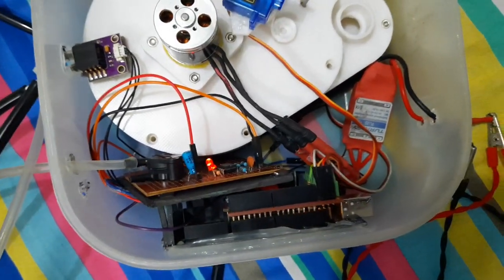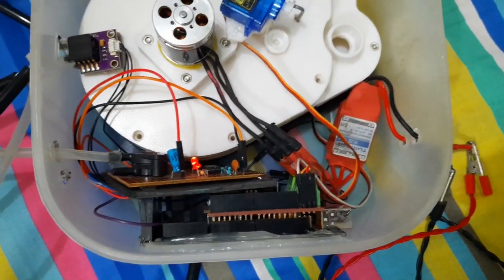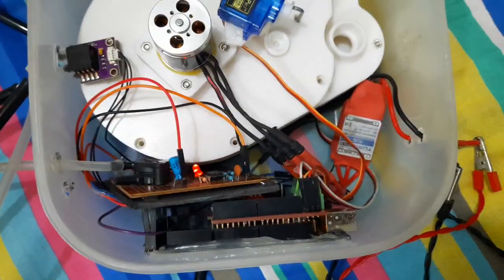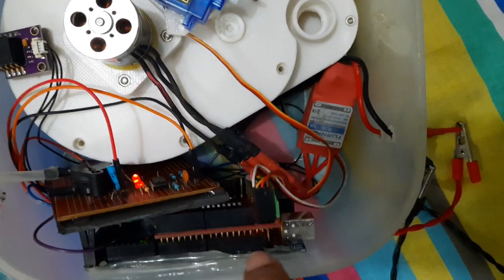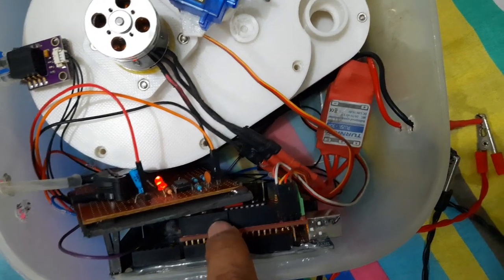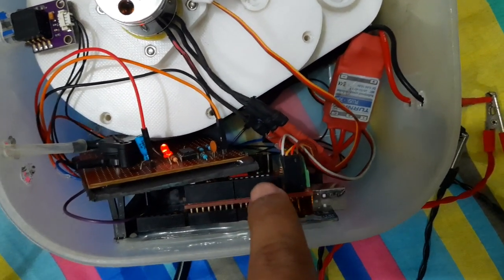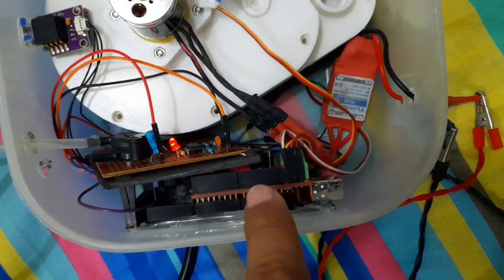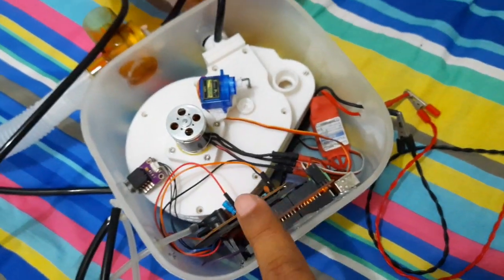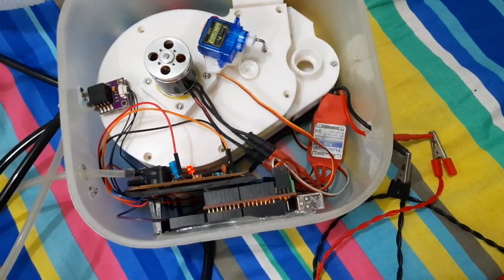And finally, in the code we are using the exponential moving average method to eliminate the sensor noise. So here we are using just a simple Arduino Mega, and here is a Bluetooth module which was designed by our company CRUX, www.cruxpd.com, and we are uploading all the data from this ventilator to our PC wirelessly using just simple Bluetooth.